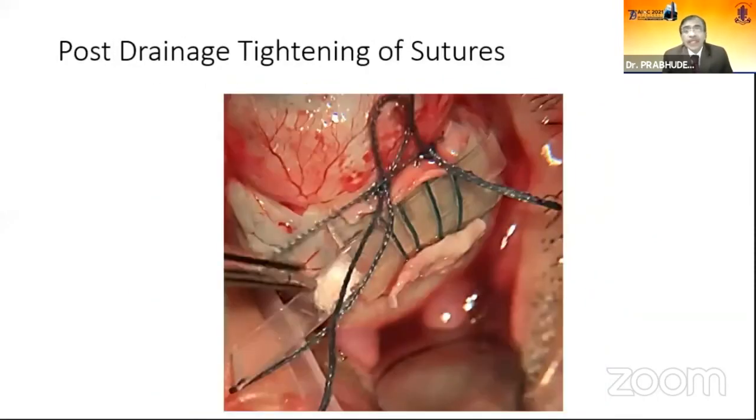Now, this is a very critical step, the drainage, because you can get most of the complications at this stage. You can get hemorrhage from the drainage site, you can get hemorrhage under the retina. So selecting the drainage site, either in the bed, usually over the horizontal recti, is very important. And you should relax your pull on the muscles a little bit when you're just poking. And once you poke and your drainage is started, you would like to pull up the eyeball so that there is no sudden hypotony leading to choroidals inside the eye.